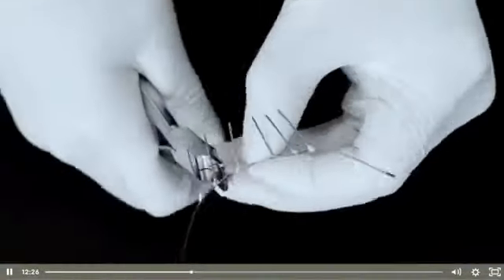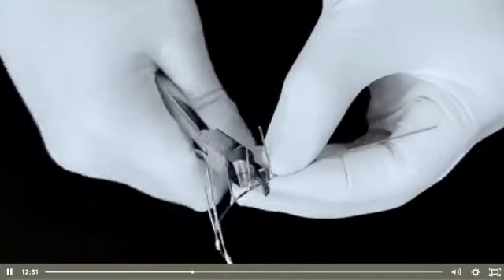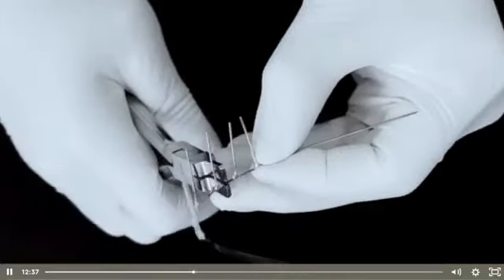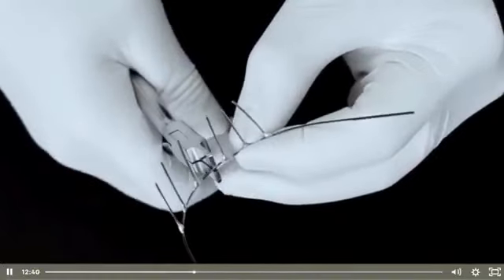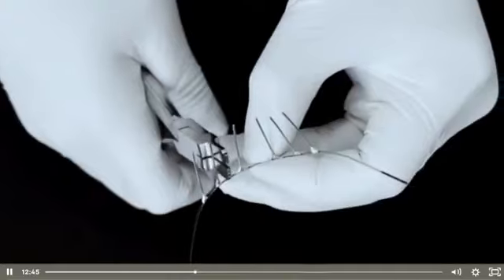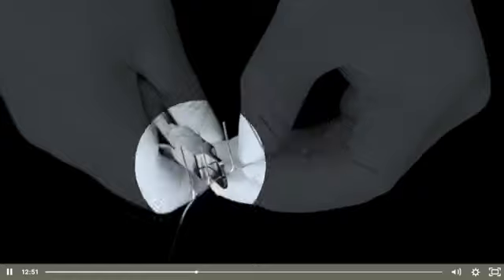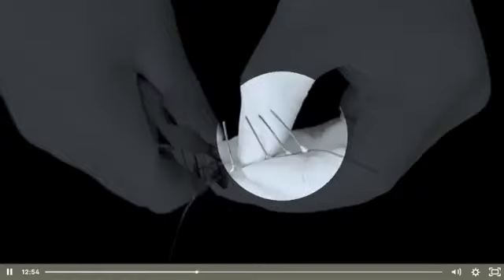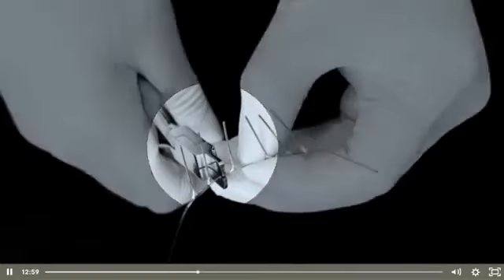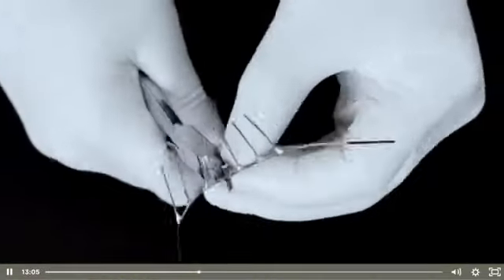Let me go again to this example here. Look, what I'm really doing is just a very delicate twisting of my wrist. This is my right wrist, and I'm doing small, very delicate torsions of my wrist, while my two fingers of the left hand are just supporting the movement here. But what I'm really doing is grabbing the wire with my two fingers and twisting it with the rotation or the rolling of my wrist. So we're going this way. I'm going to do it again so you can see.